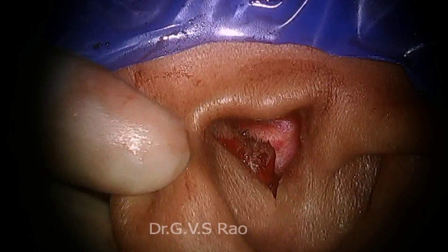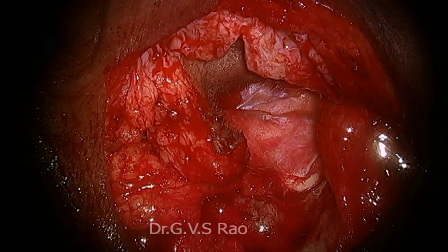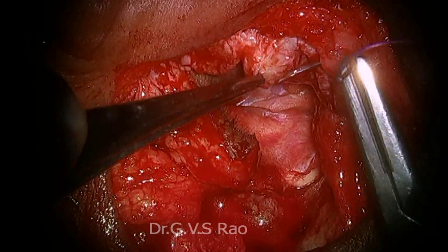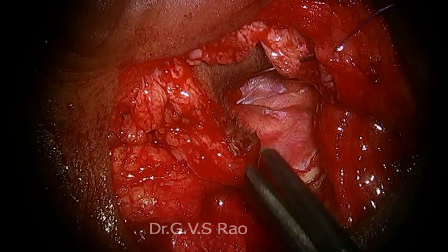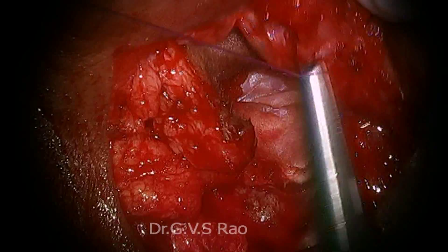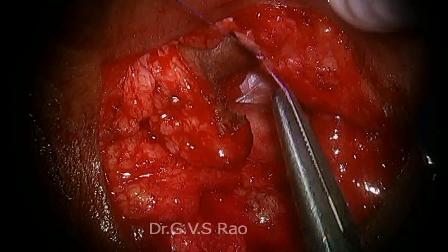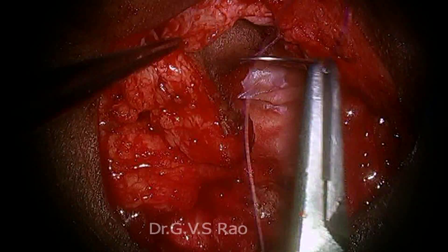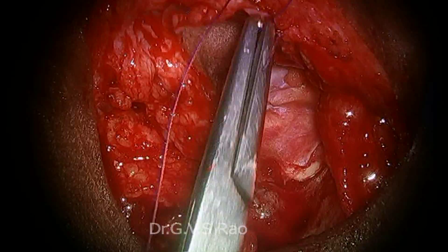Two minutes — how the conchaplasty will be over. Tooth forceps. Now see — I think these are the cases they suggest blind sac closure, but because of the facial nerve we proceed differently. See how beautifully the concha will appear within another 2 minutes. Whatever raw cartilage is exposed, that is what I am covering with the skin now. See another piece — this is the skin going back, this is the raw cartilage — covering that cartilage.